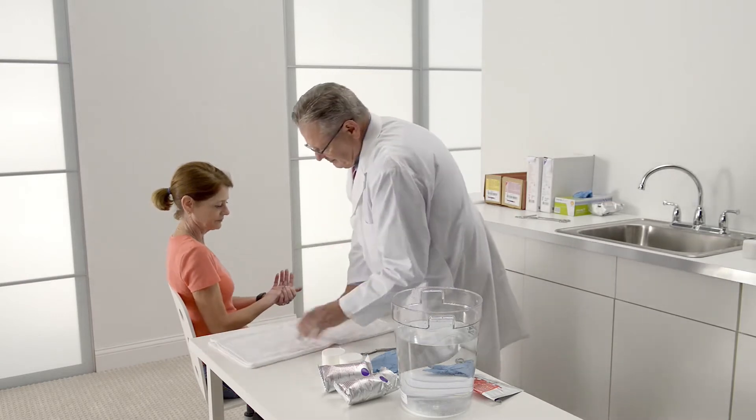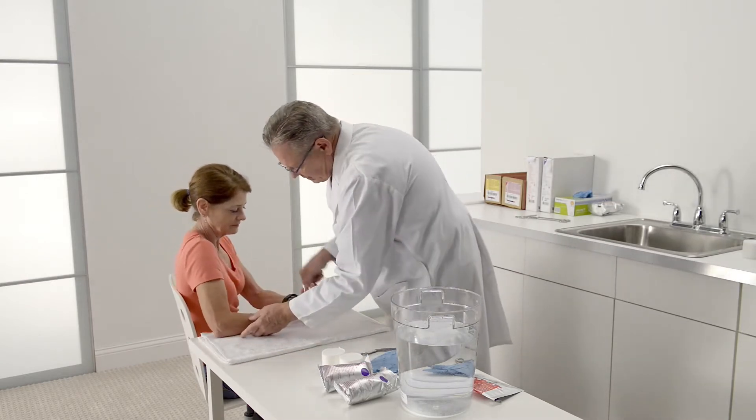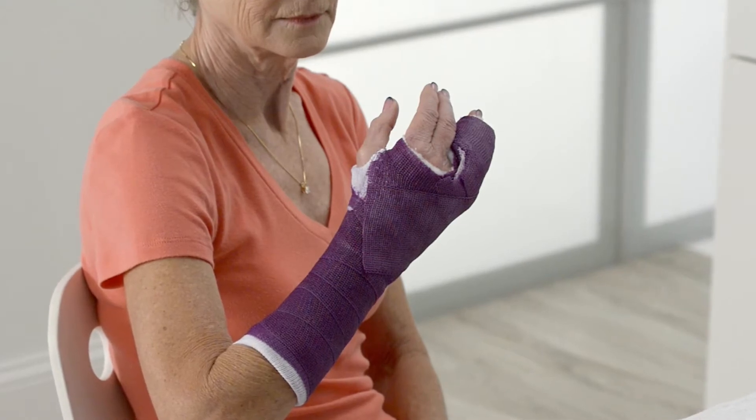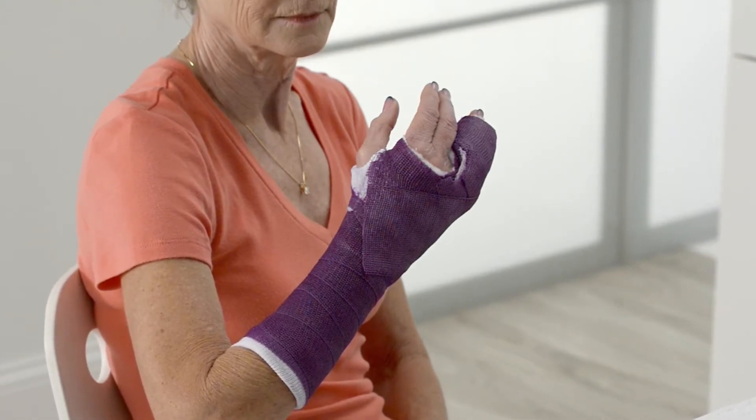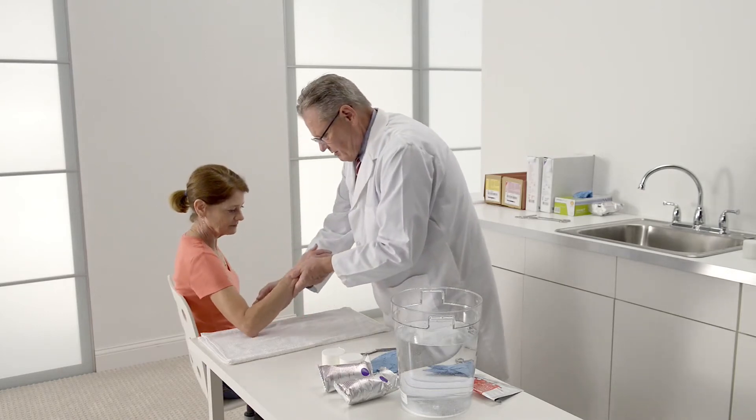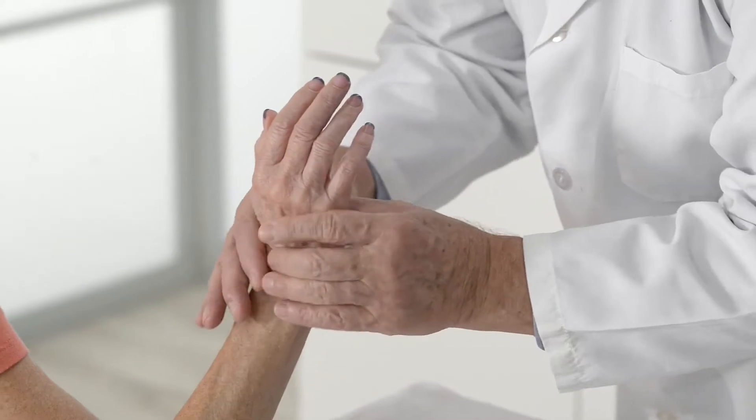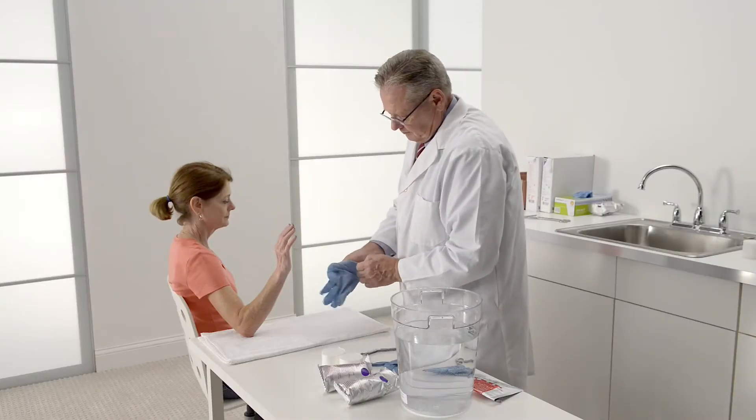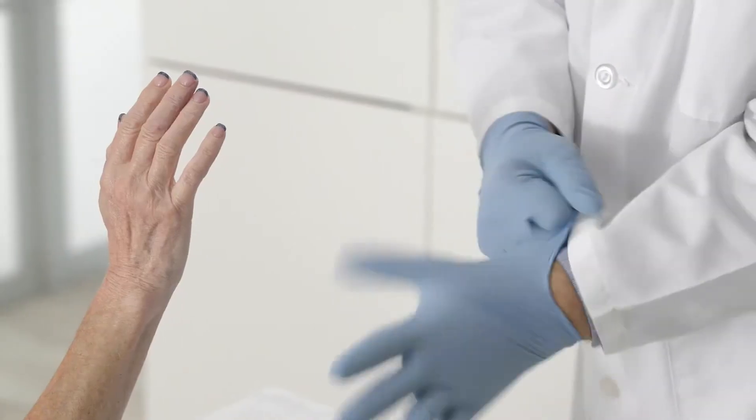Remember to cover any clothing or surface that you want to protect from staining. When finished, the cast will wrap around the affected fingers and extend to just below the elbow. Make sure the patient is comfortably seated with a neutral arm position and affected fingers in alignment. Ensure you wear examination gloves throughout the whole procedure.